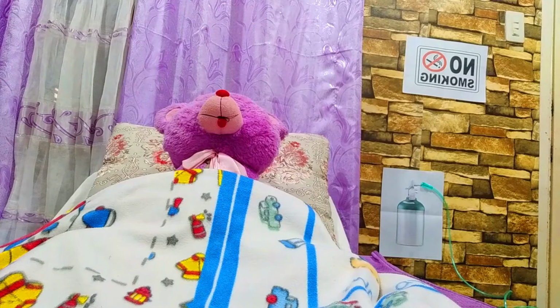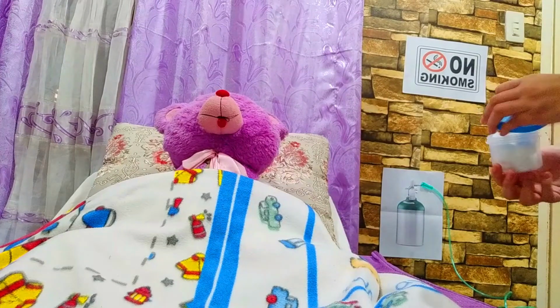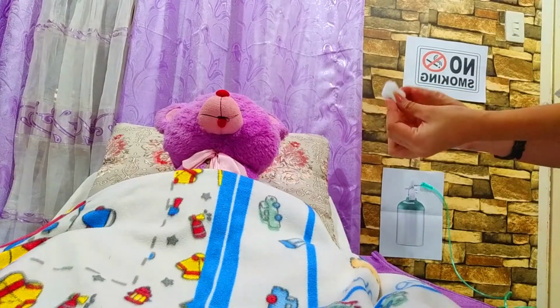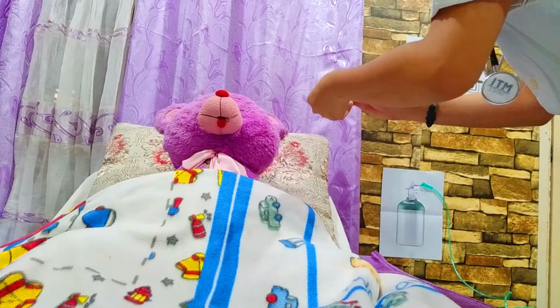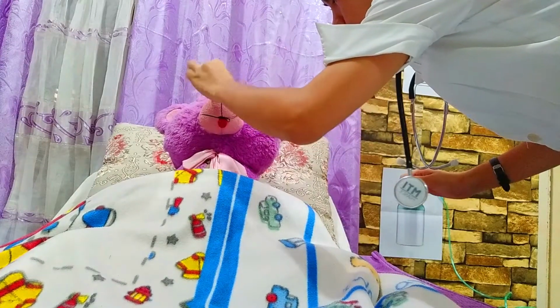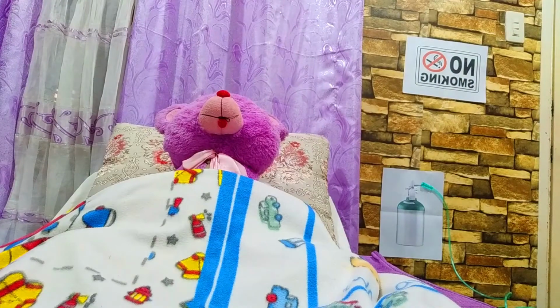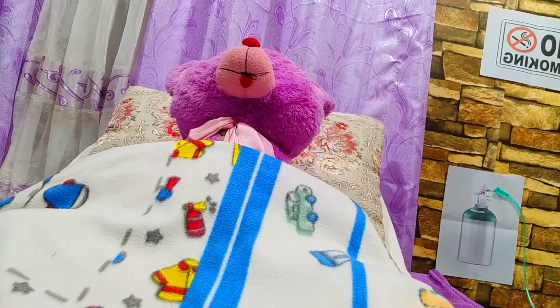And then, for placing the nasal cannula, first we need to clean the nostrils of secretion with moist cotton balls. And the next is we need to place the cannula prongs upward into the patient's nose.